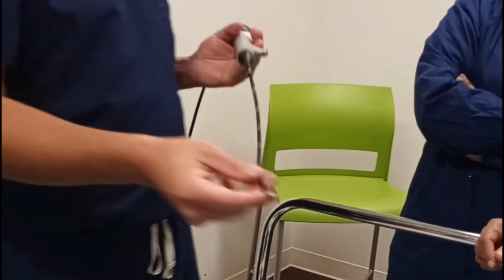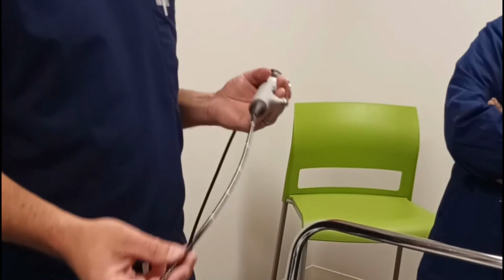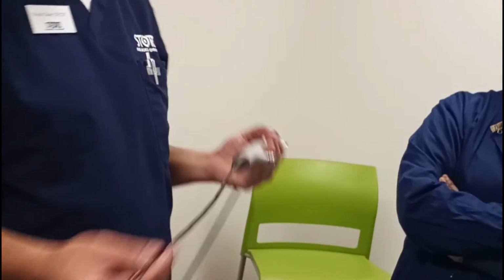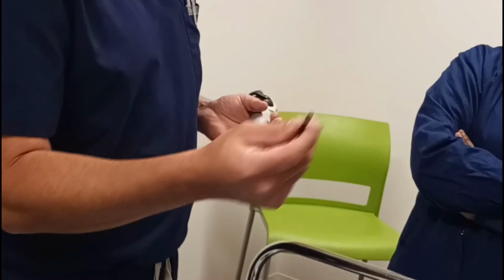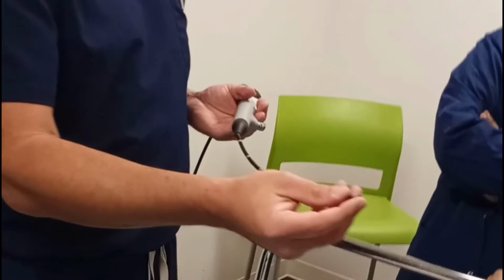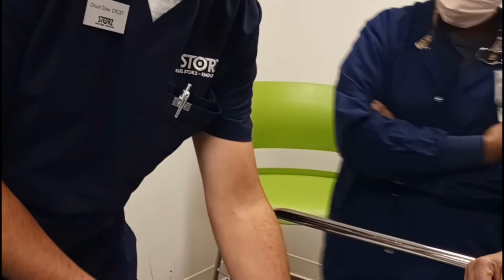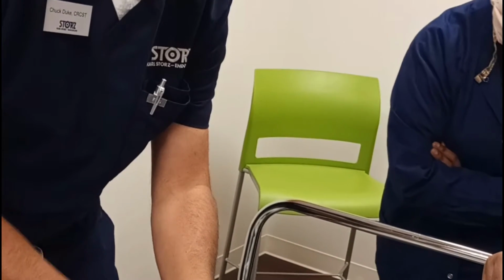And then when they go to use it, I've seen it where they stick it inside the patient and then they're like, oh my God, I can't see anything. They pull the scope out and ask for a new scope, and I come in and look and see the rubber is just over top of the distal lens of the scope. What I do is I really gently take my two hands and pull the rubber back.